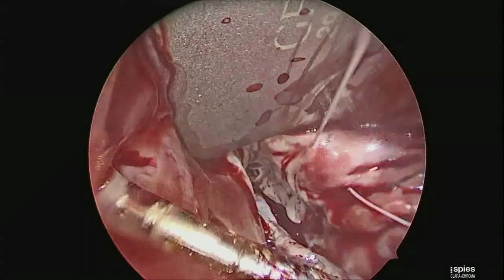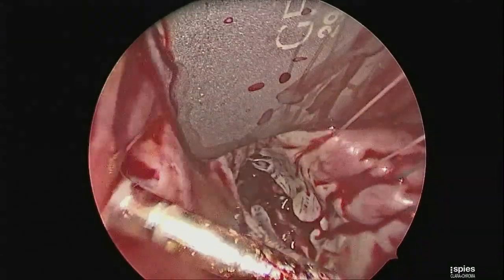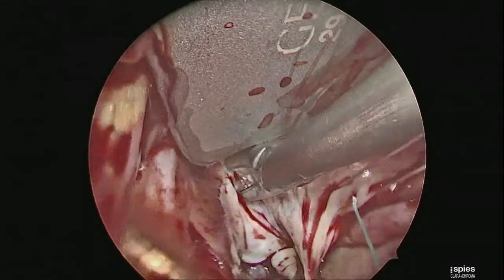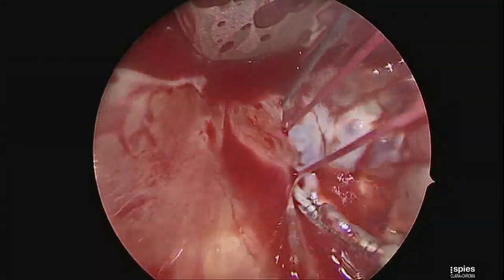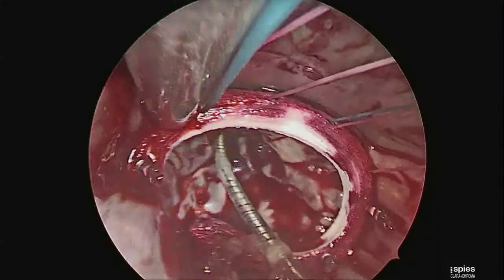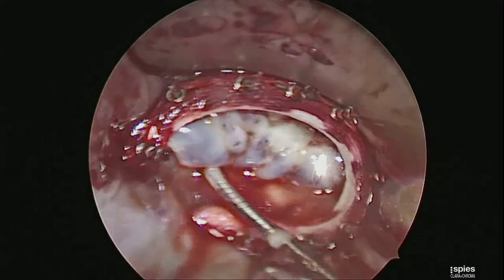The annulus is sized to a 28 incomplete band. The annuloplasty sutures were placed using 2-0 Ethibond. The valve was retested, finding good competence, and the 28 millimeter band was secured in place using titanium fasteners.